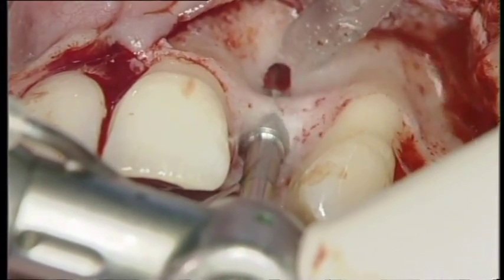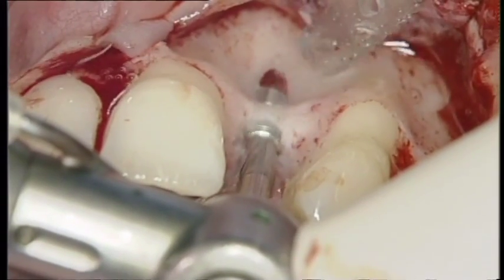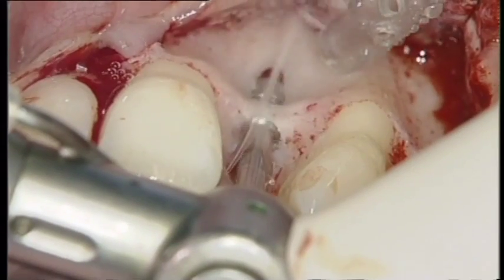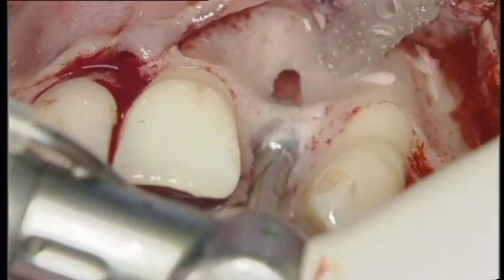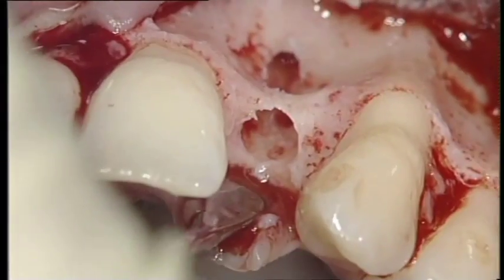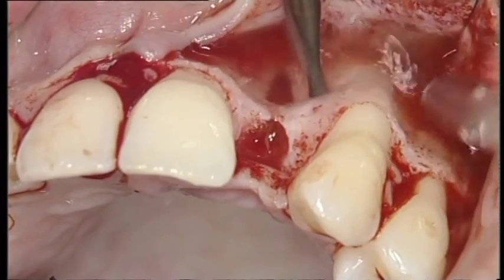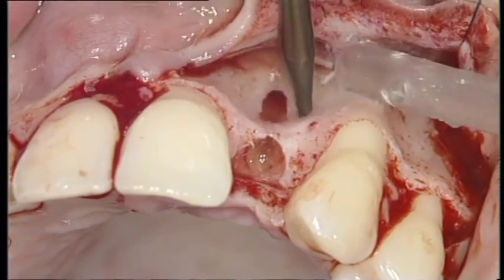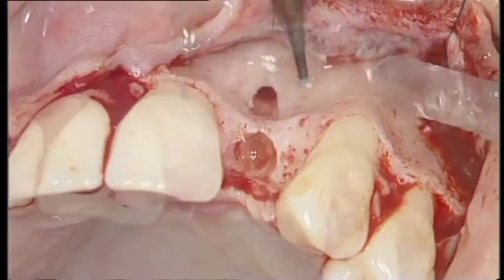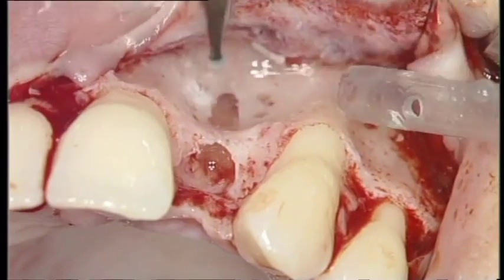A special profile drill for a 3.3 millimeter bone-level implant is used to expand the coronal part of the implant bed. The facial bone wall is less than 1 millimeter thick, whereas the intact palatal bone wall has sufficient thickness. The cortical bone surface is perforated in the peri-implant area with a small round burr to open the marrow cavity and to allow bleeding into the augmentation area.